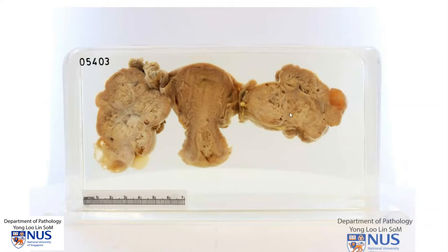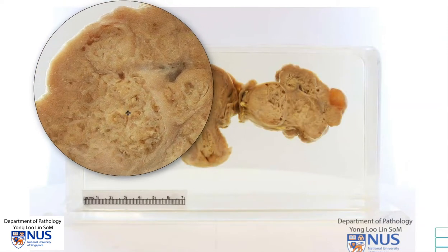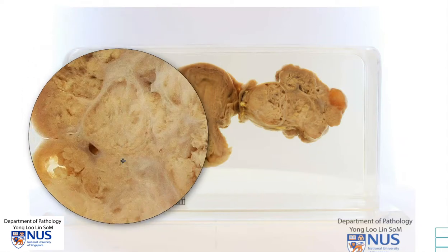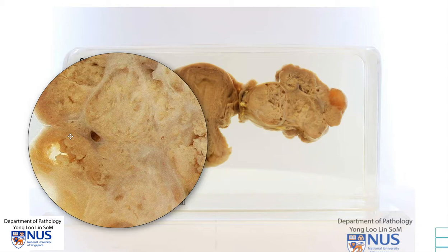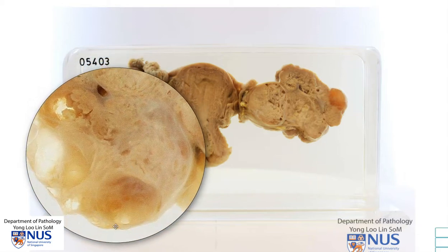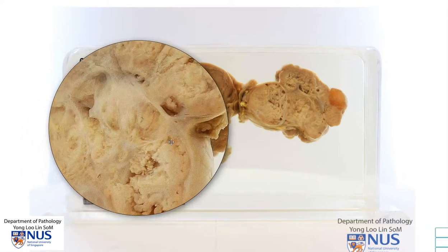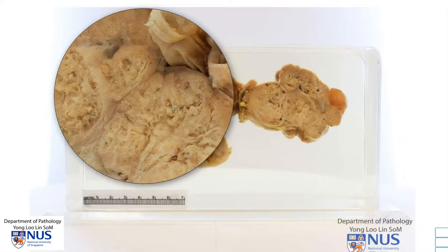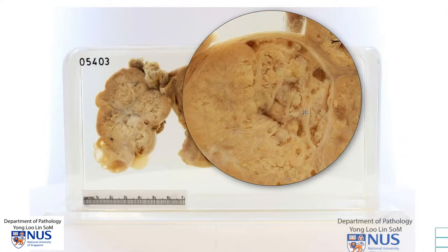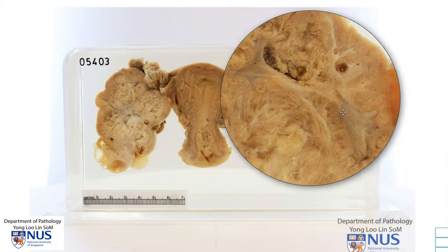Looking back at the cut surface, we can see in the right ovary that there is a nodular mass which is whitish to yellowish. Some areas actually appear a little bit papillary in architecture and we can see that there are some cystic areas, but most of the tumor is quite solid in appearance. Similarly in the left ovary we can also see the same appearance.